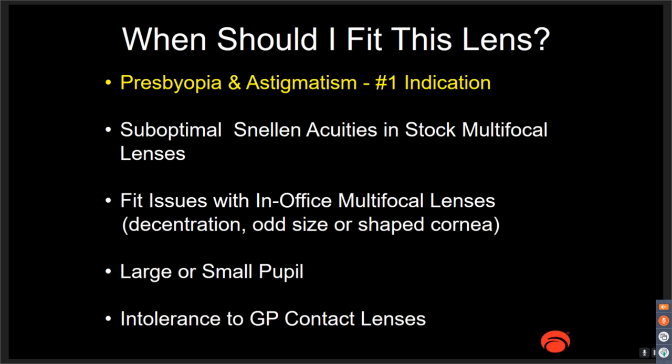Basically, as we get older, we all realize the pupil gets smaller, but you'll have a patient that'll be 65, 70 years old, and they'll have a 4.5 to 5 millimeter pupil, very active yet. You'll have sometimes young people in their mid 40s that will have very small pupils. So all of the standard lenses out there are based on just averages, and not everybody is average.